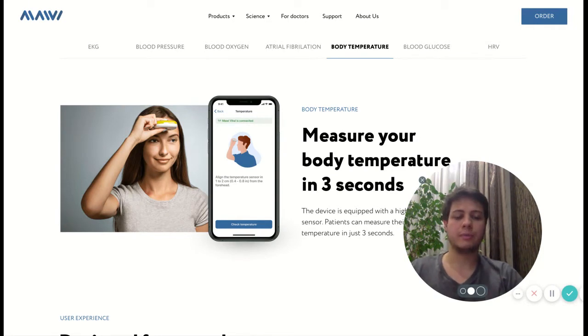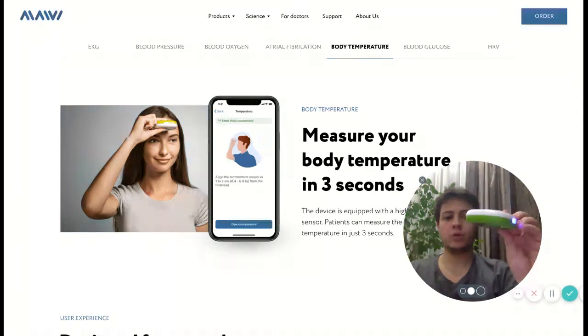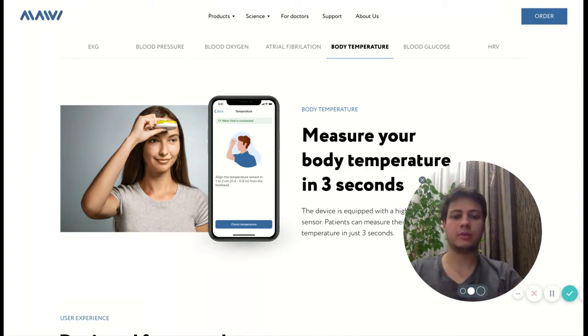Hello, today I want to introduce you to the MyVital device and show a small lifehack on how to measure body temperature correctly.